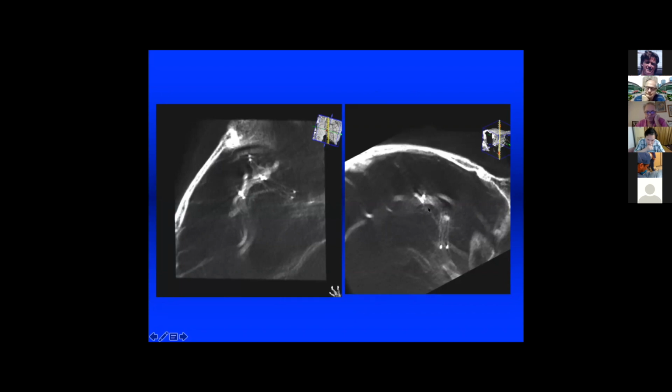The patient had a good evolution, 24 hours, stand up, no problem. But I don't like to use the endosaccular device to treat the aneurysm. In my opinion, I don't use it. I prefer to discuss with the neurosurgeon, your clipping, your bypass, whatever you want, or reconstruction, but this material is dangerous. And every time you have possibility of remnant neck, I don't like this device.